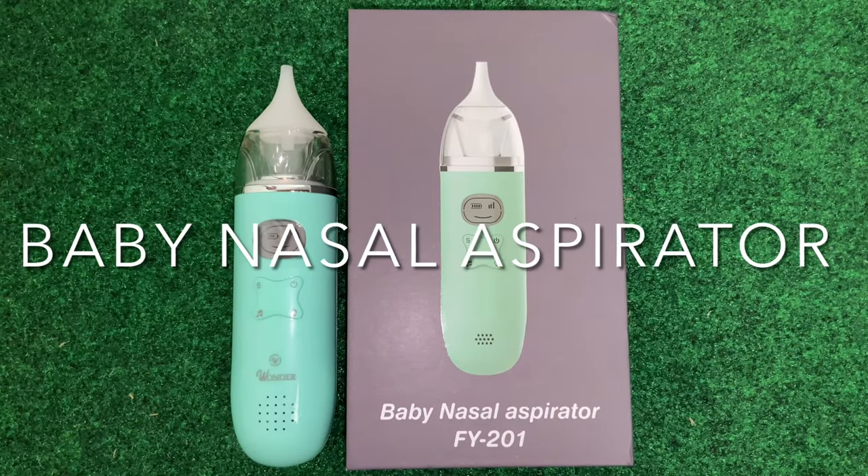That product is a baby nasal aspirator. Simply put, this device is going to use suction to remove any mucus in a baby's nose so that they can breathe better. As we can see here, our product does come in three different colors.